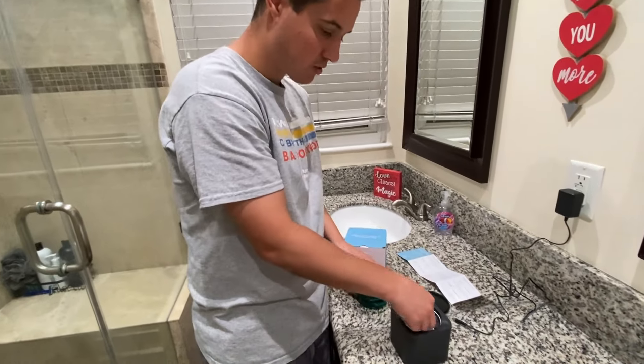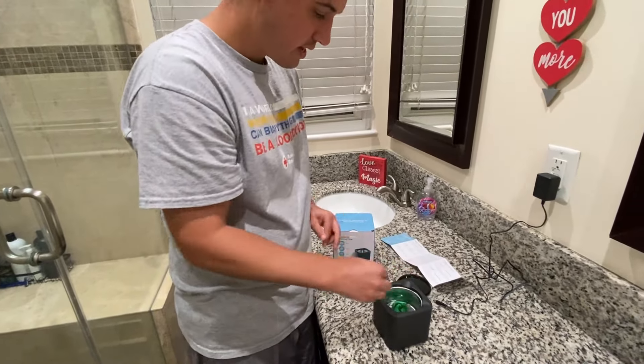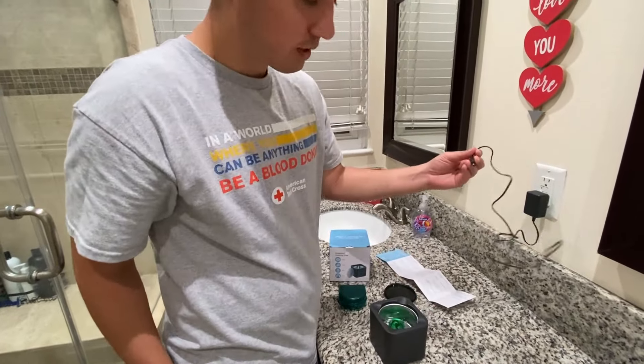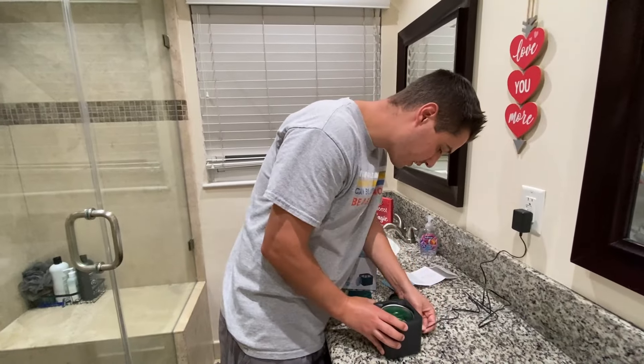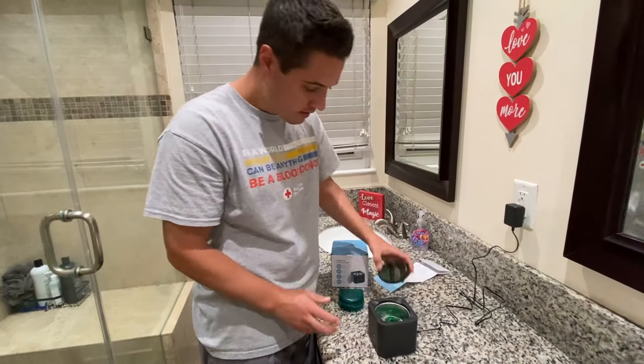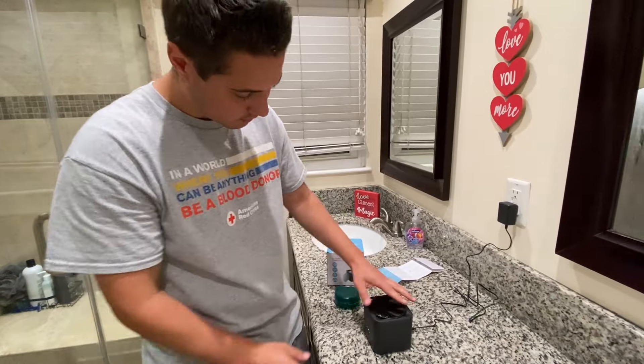Then you just drop the object you want to clean in it. You do have to have it plugged in — it comes with the plug. It also comes with directions on how to use it. So we're going to go ahead and plug it in, and it also has a lid, so you want to make sure you put the lid on.